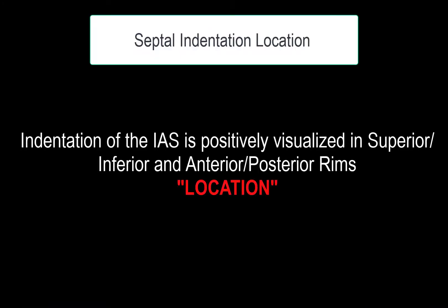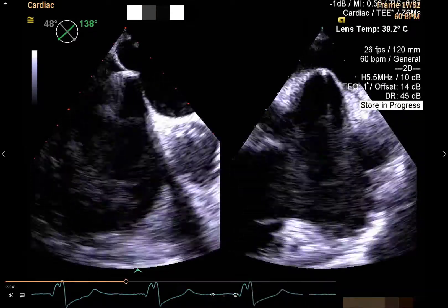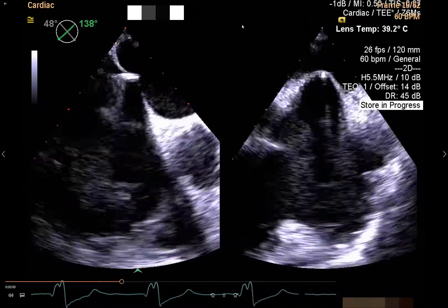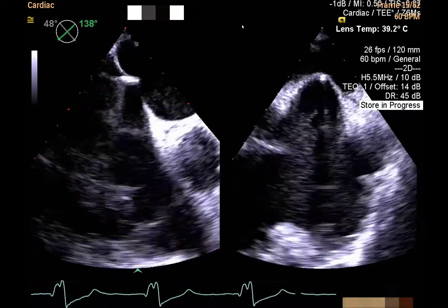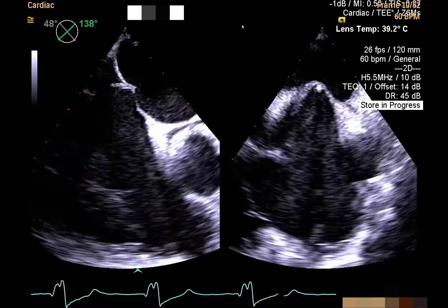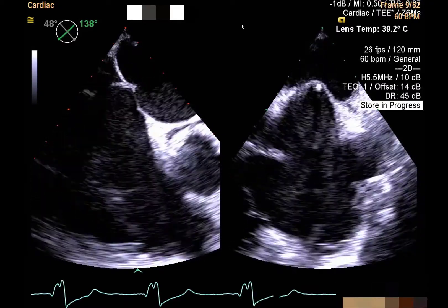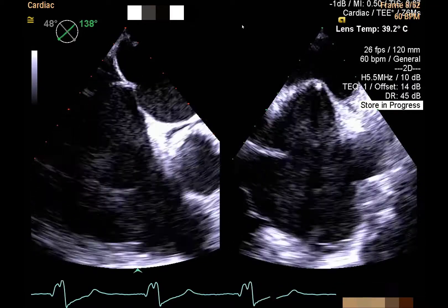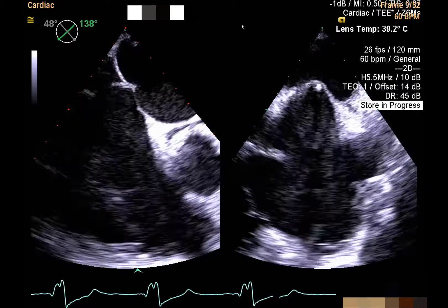At the location stage, the location of the maximal septal indentation in the fossa ovalis is established. The key point is to simultaneously demonstrate the maximal indentation with the superior, inferior, and anteroposterior rims. This may require elevational adjustments of the lateral plane for optimal display. Once the indentation has been identified, it should always be kept in view.